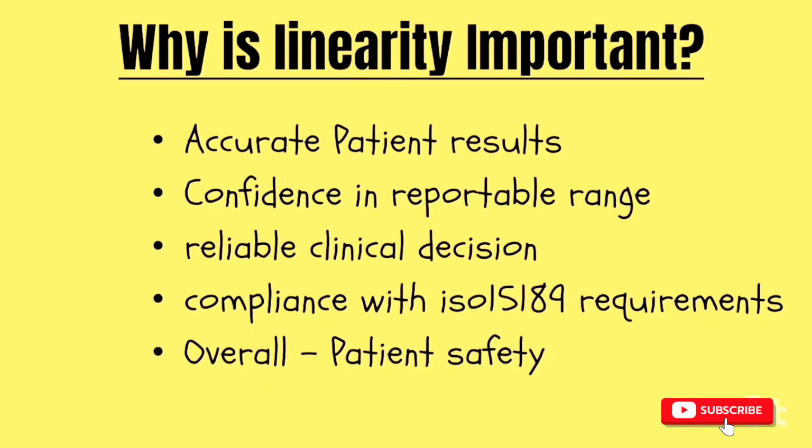So it helps with reliable clinical decisions, because it can help the clinician to make a decision that can benefit the patient. Of course, it's compliance with ISO 15189 requirements, and overall, it ensures patient safety. So the whole essence of making sure that we get a result that is within the linearity is for patient safety. Very important. It's for accuracy. It's for confidence and all of that. Okay.